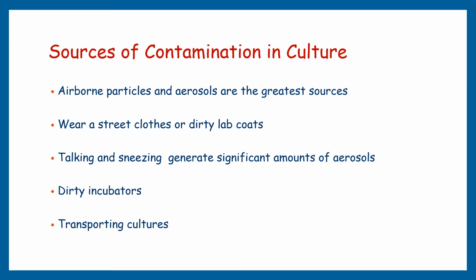Street clothes or dirty lab coats are significant dust magnets, and placing dust-laden sleeves into a laminar flow hood generates a cloud of dust particles that can easily fall into and contaminate cultures during routine processing. Mycoplasma contaminates your culture very easily if you are talking and sneezing, which can generate significant amounts of aerosols during routine practice.